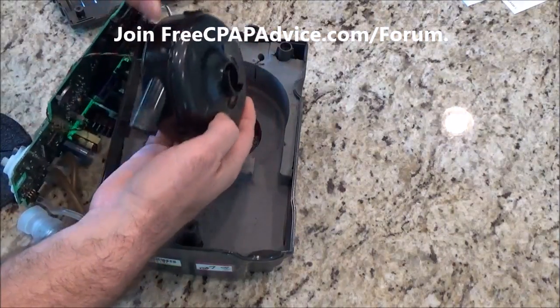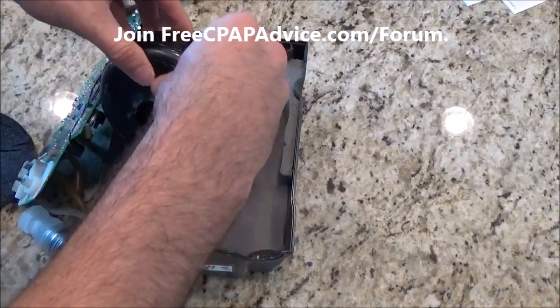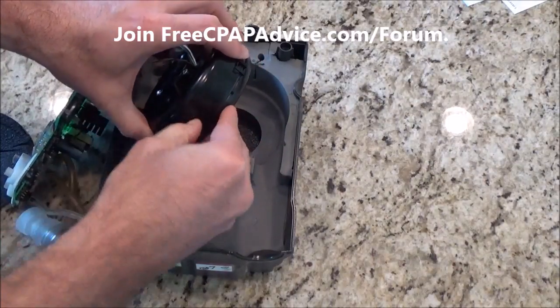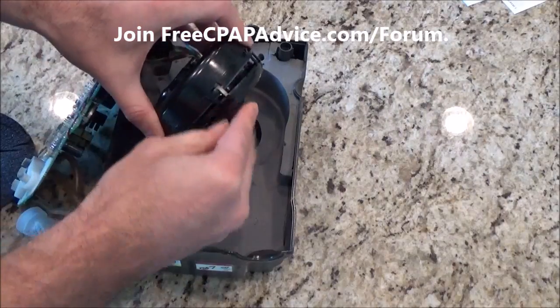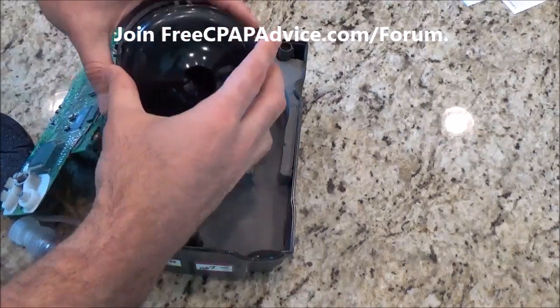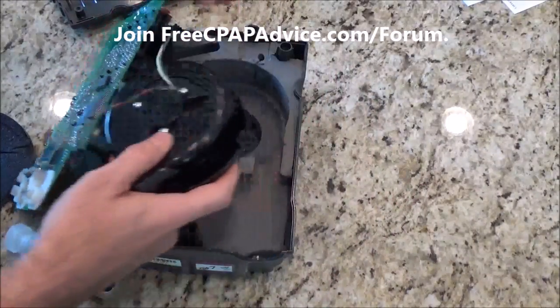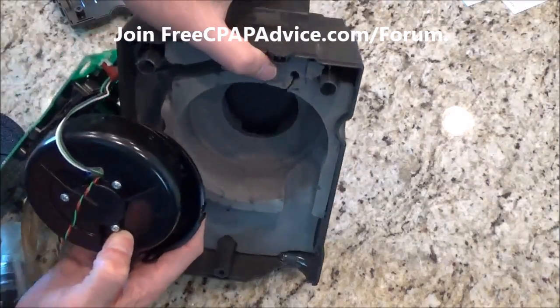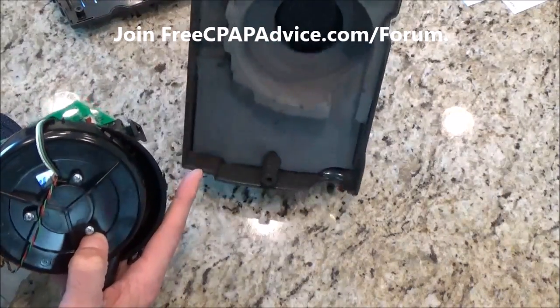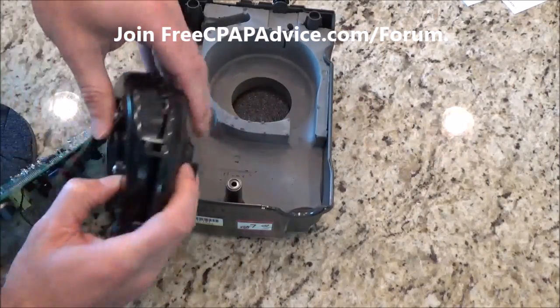It looks like it's just little clips here, so we're going to pull these off. Man, there's like a ton of them. Gotta say, I'm not as impressed with what's in here as I thought I would be. Okay, so let's see, this side was down. And it looks like it feeds, you can see a hole down in here. It looks like it's sucking air in and through this, going down and around and sucking it in from this side, pulling it in through here.